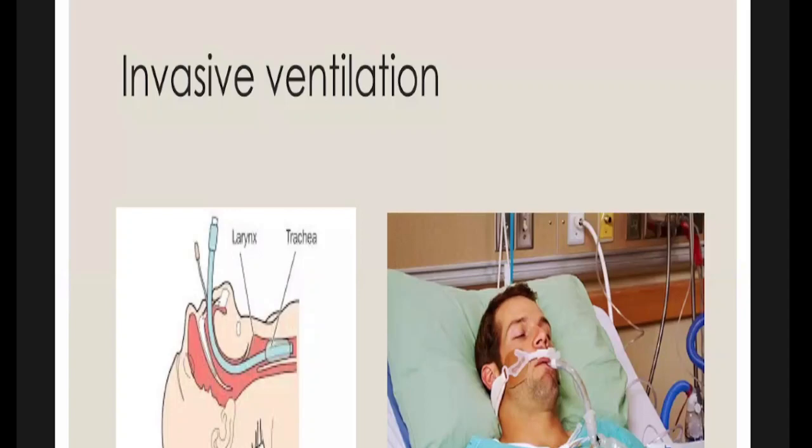So this is a closed suctioning system, right? This is a suction tube that is connected to the suction catheter on either side onto the wall sucker system. And this is a closed suctioning system that can go into the ET tube like that. Whenever there are secretions, it can suck them out and clear them. Then the tube comes back and lives inside this plastic or polythene sheet, so it won't get contaminated by touching anywhere else.